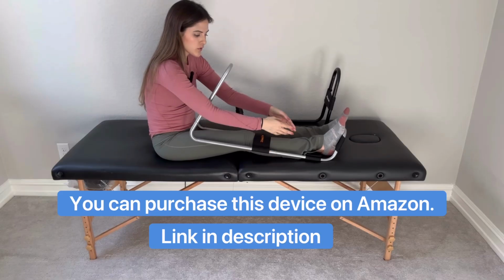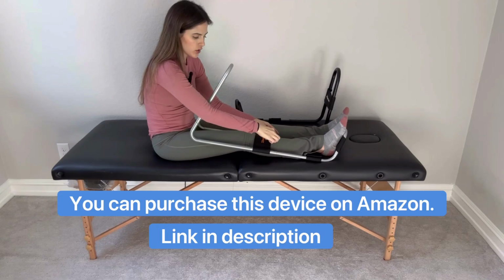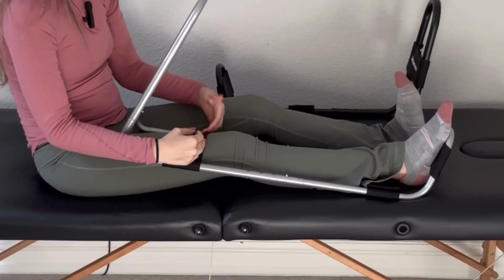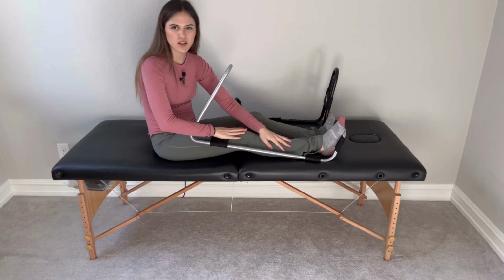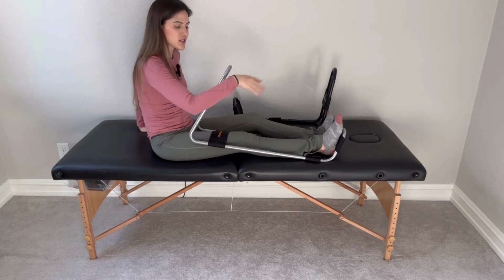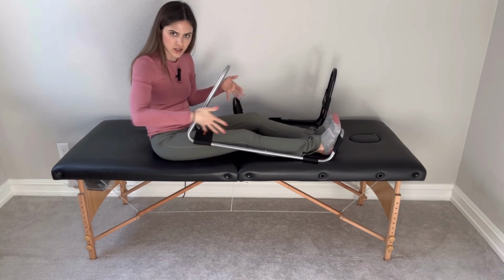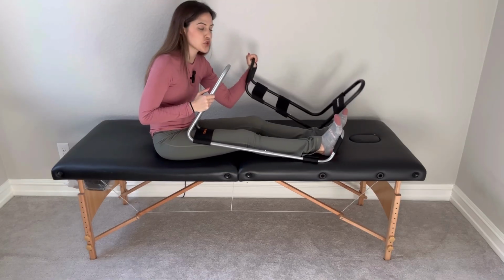So this strap that moves up and down is really beneficial because if your incision is down at the bottom here, you will need to move this strap up at the top of your incision where it's not touching and irritating it. I know that incision can be really irritating if you put something on top of it. So the strap moves for that exact reason. So if you have a nice long leg, this strap moving back and forth is going to be really handy. Also, the length of this thing is going to be really handy if you have a long leg compared to this one over here. This one's much shorter.